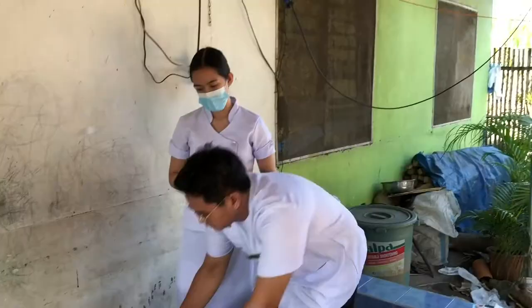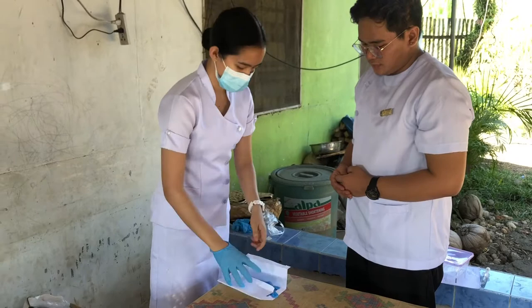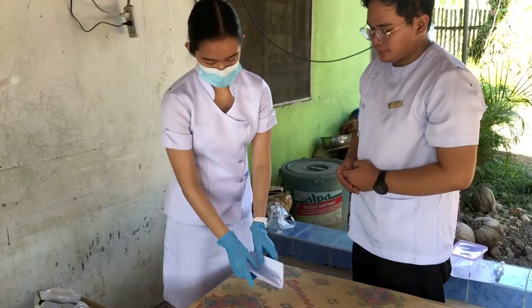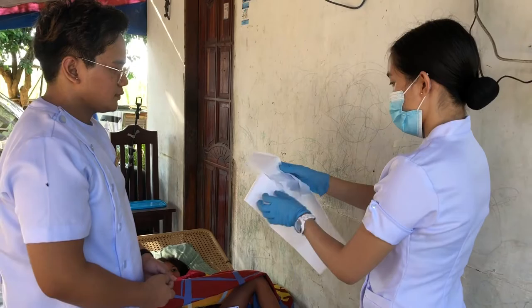Let the doctor open the pack of sterile gloves to put on gloves. Preserve sterile technique in offering pack of towel with hole for draping.